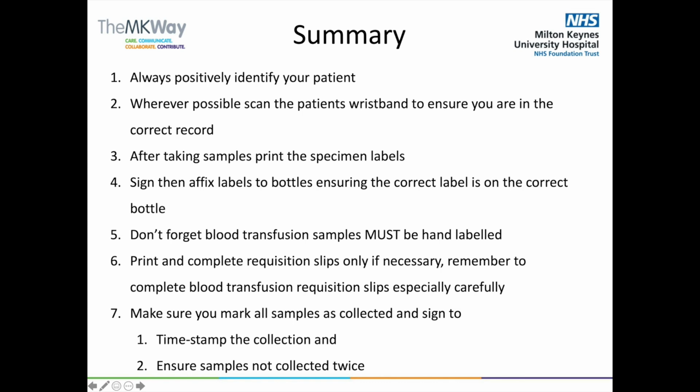Print and complete requisition slips only if necessary, and remember to complete all the fields on blood transfusion request slips especially. Finally, remember always to mark your samples as collected to 1. Timestamp the collection, and 2. Ensure that samples won't accidentally be collected again.